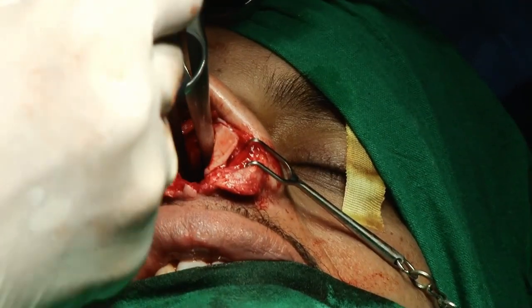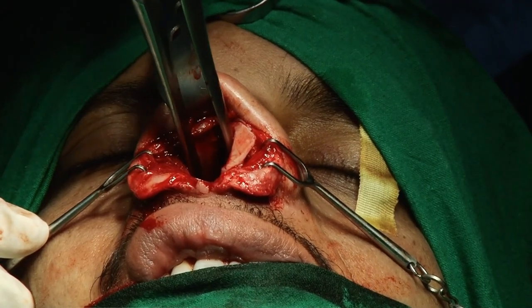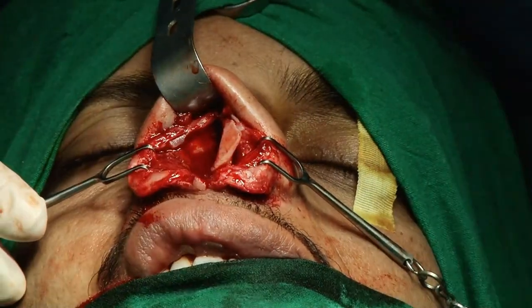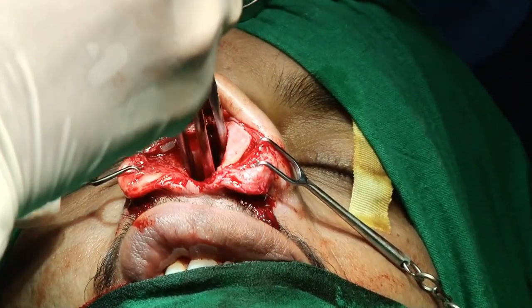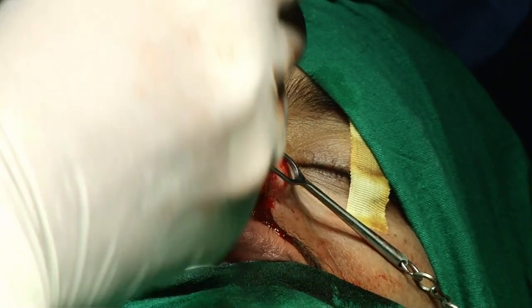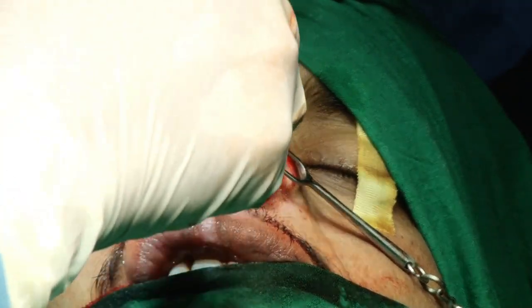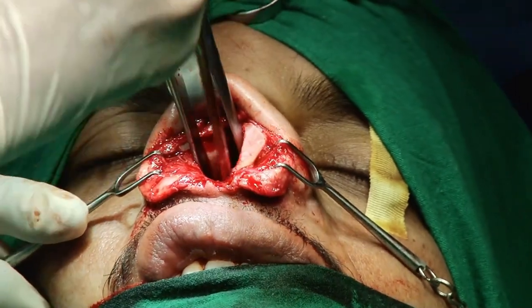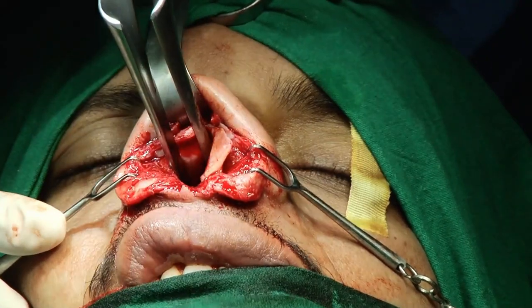Periosteum. Okay. This is the deviated part, that is the posterior part. Now we just do a little bit. After the harvesting, this is the PP part posteriorly. And you should try to harvest as big a piece of cartilage as you can for the reconstruction.